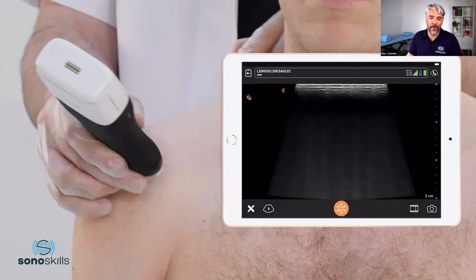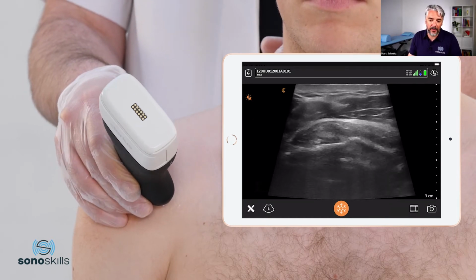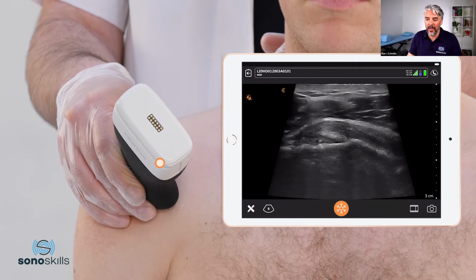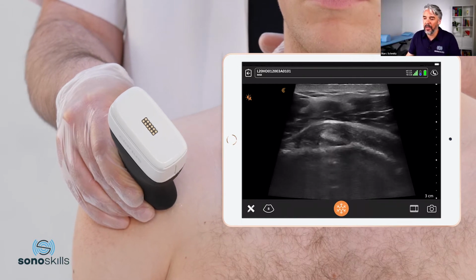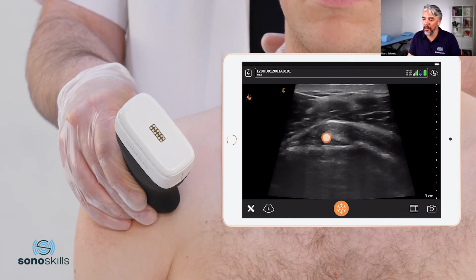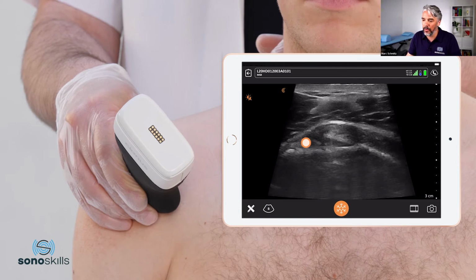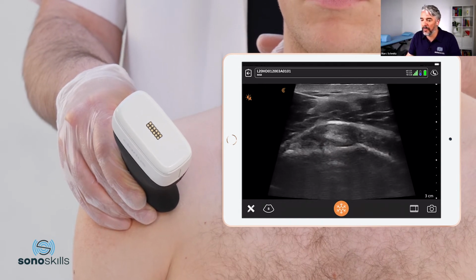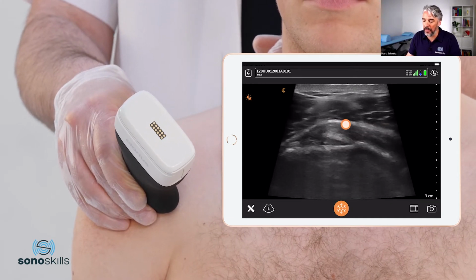So let's go to scanning, how to scan this. We are going to place the transducer on the ventral shoulder in a little bit of a diagonal way. We are going to follow the biceps up to proximal. It curves around, and then there you are going to place the transducer. And what we are going to see is this long head of the biceps tendon on top of the humeral head right there. And the long head of the biceps is indeed stabilized with this superior-glenohumeral ligament and also this coracohumeral ligament, which is crossing or topping the biceps.